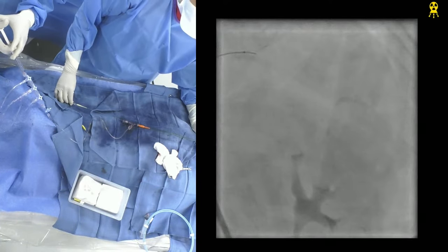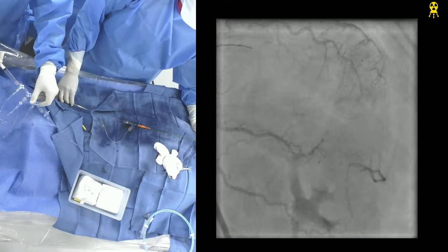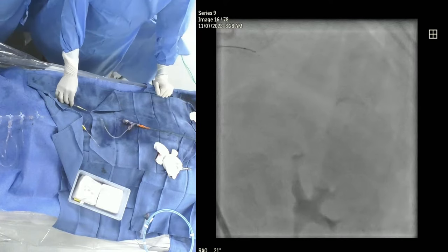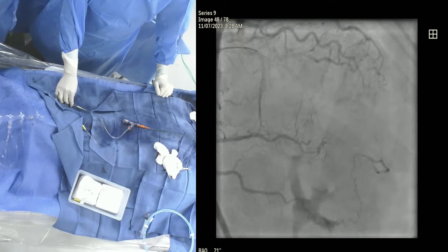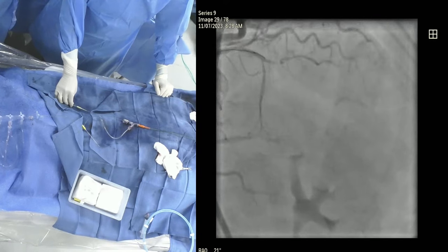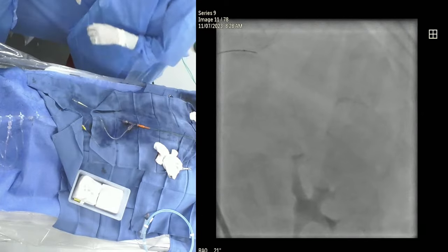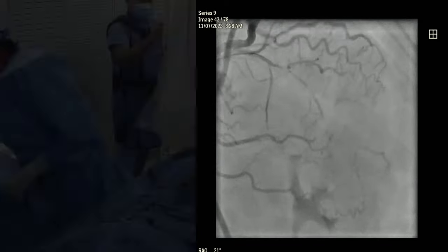Okay. Yeah, now you see a little better. See that calcium proximally, but at the site, no. And there, those are the bifurcating subtotal lesion, LAD, and the angulated diagonal. That's where we are now. Also get the Mongo ready, okay? So tell us, what is your next strategy?